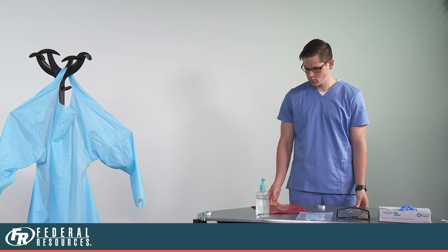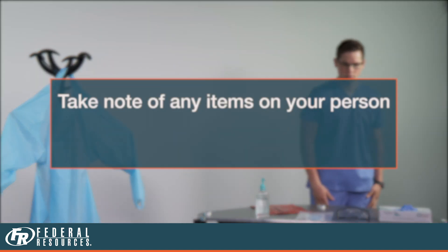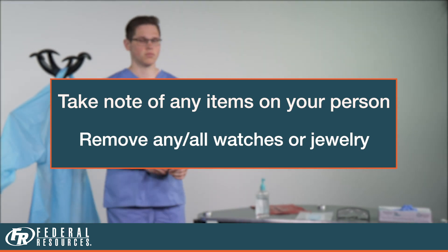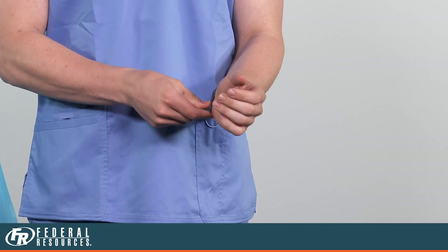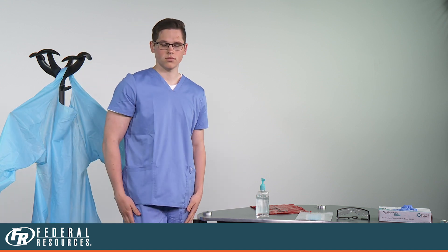Stage your equipment in a clean area where you can safely don your PPE. To start, you want to think about what you have on your person. If you have jewelry such as watches, rings, earrings, or necklaces, you may want to consider taking those off as they can be a nexus for infection.